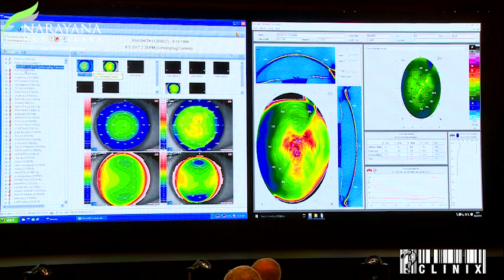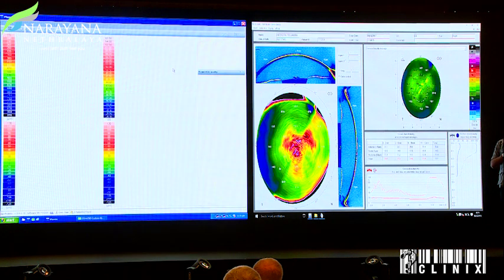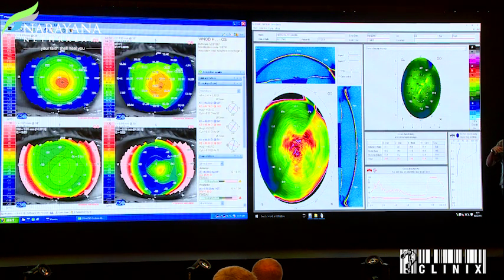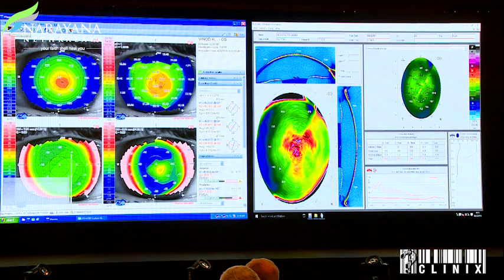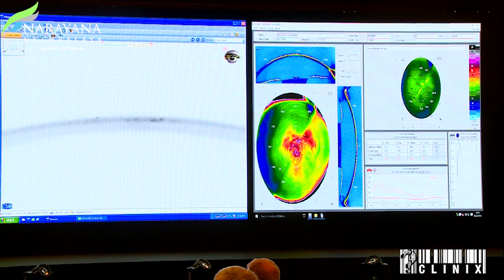Any other questions on keratoconus indices or anything? The ABCD, I think only some machines have it. They've not loaded it in all the machines, and the full version of ABCD, Professor Belin's, is not available to us yet. So people have not really started using it here. The original version, what I showed you, is the current version, which Oculus has had for almost a year and still has not released. But this is the second iteration, and it has a lot more flexibility to it. But the primary one's been out for 2 years, maybe.